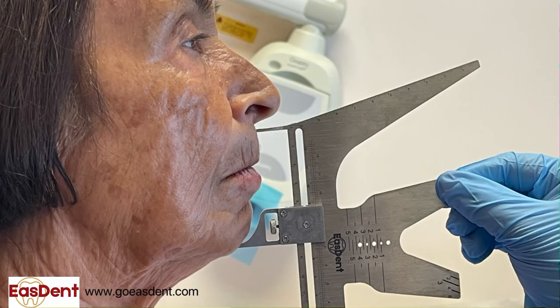You can verify the VDO with the patient's VDR by measuring from the lower border of the septum of the nose to the lower border of the chin when the patient is at rest. The outer edge of the shorter stick should be 4 mm from the nose at rest. This 4 mm includes the 2 mm you leave for the actual final impression thickness and 2 mm of freeway space.